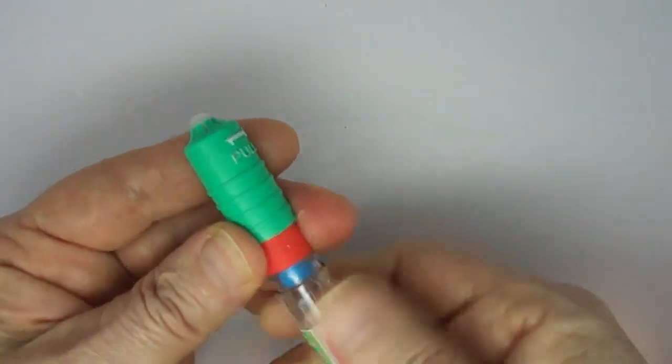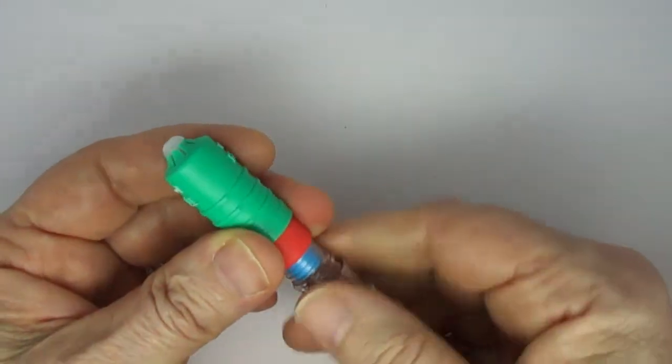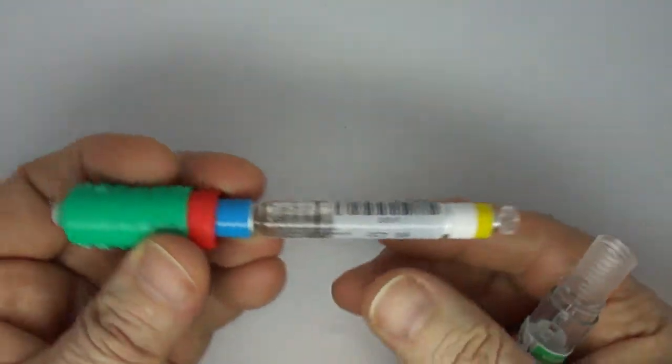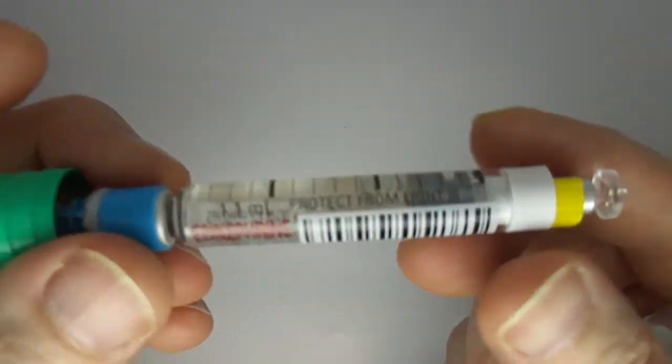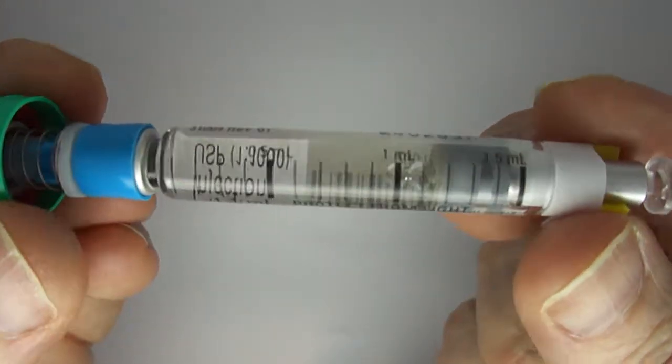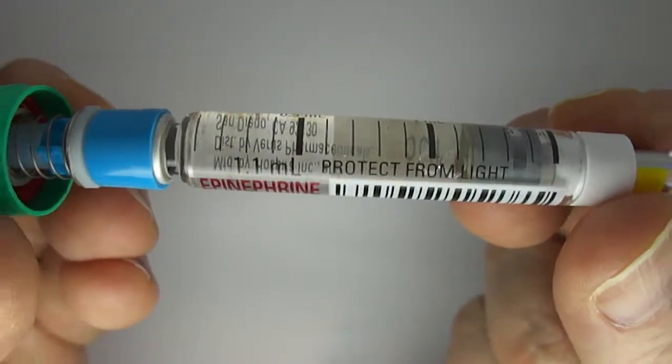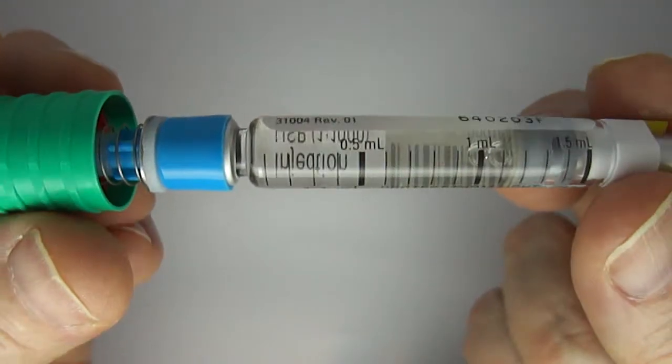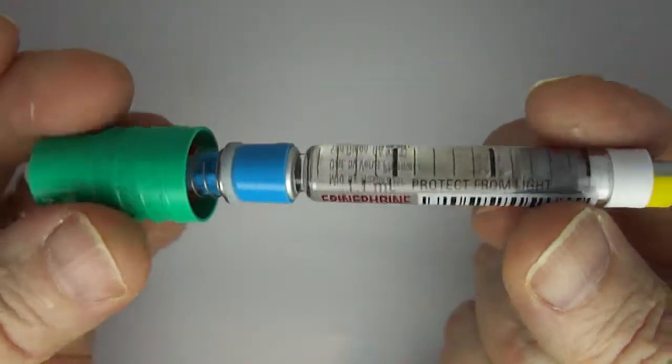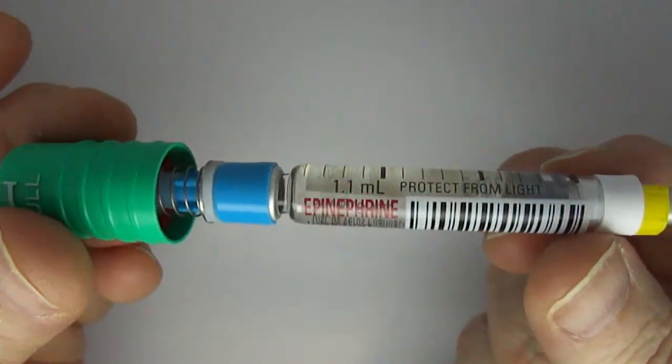If I cheat a little bit—you're not supposed to do it this way—you can actually open it up ahead of time and see that it has this syringe inside. It has a little bit over a mil in there and this is one one-thousandth or one milligram per mil of epinephrine.